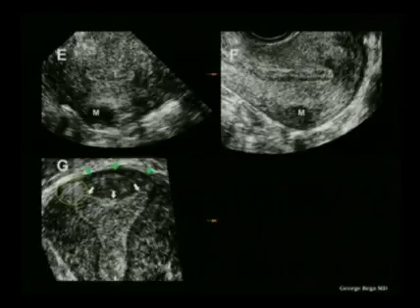Another very interesting artifact is the enhancement artifact, especially in the uterus. You see it in the coronal plane. Here in the coronal, on the right side, you see that there is an enhancement artifact. Otherwise, this is the so-called coronal plane. This is a unique plane because it's perpendicular to the image acquired by the beam. This is a sagittal, this is a transverse, and this is a coronal.